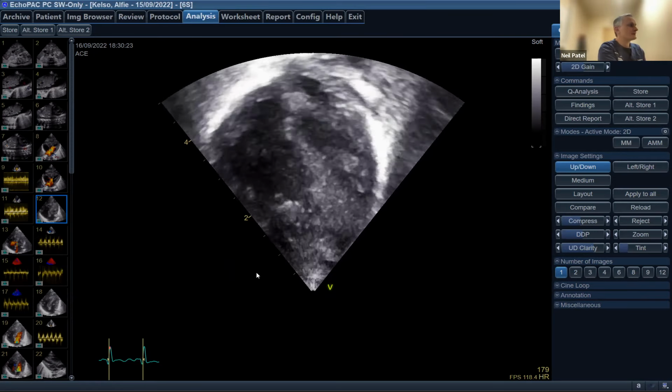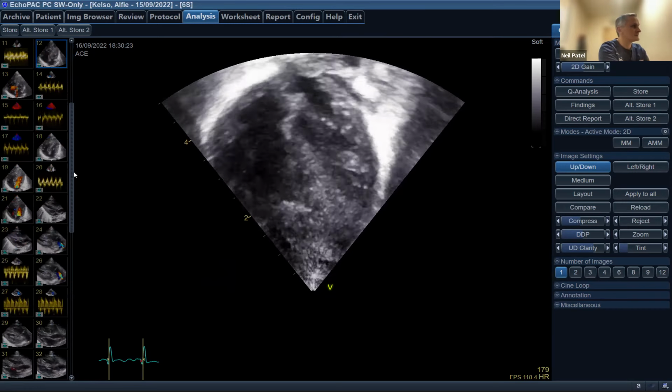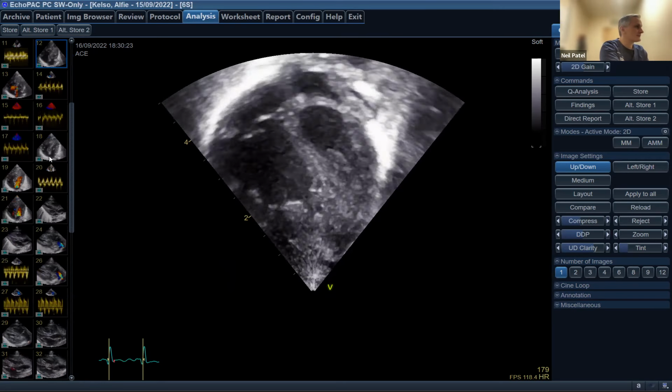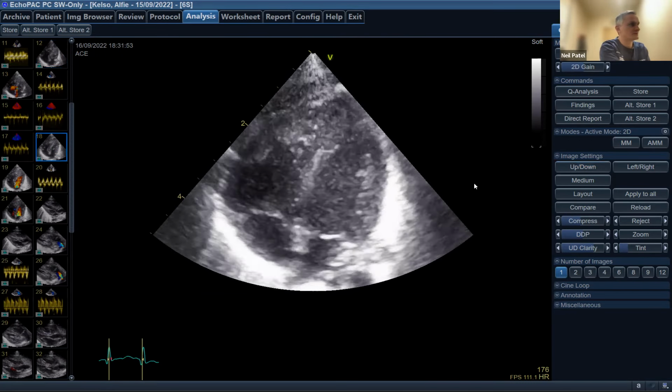Anyway, clearly it's even better when we can add a level of quantitative objective analysis, and that's what I'm going to specifically show you with speckle tracking. So let's start with the left ventricle in the longitudinal plane. I'm going to look at it in the inverted image just because that's what I'm used to doing.